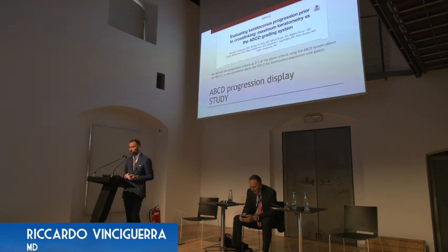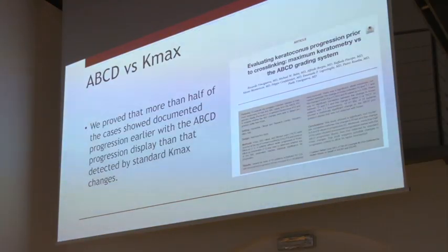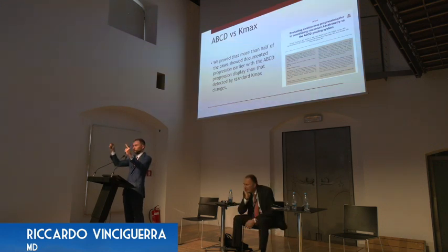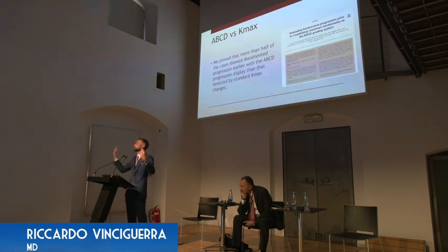I published a study some years ago in which I demonstrated that half of the patients that we included for cross-linking with the national health system, where by definition in Italy, unfortunately, the criterion is 1 diopter Kmax change, and so on. So imagine that you have some of these patients that, instead of coming twice because they had a 1 diopter Kmax change, came another time and had, I don't know, a 0.6 Kmax change. But I had the Pentacam. At that time, I didn't have the MS-39. So I had the Pentacam, and I measured that half of those patients were already progressive before.